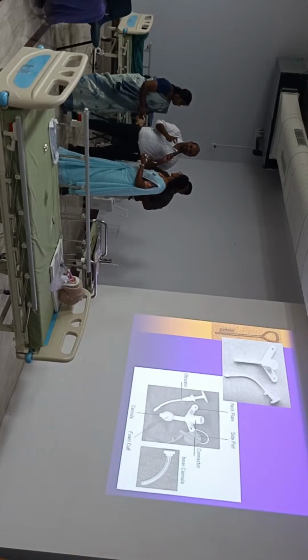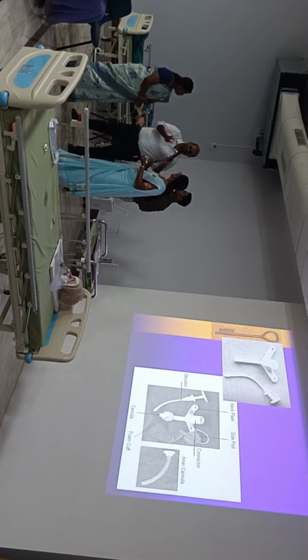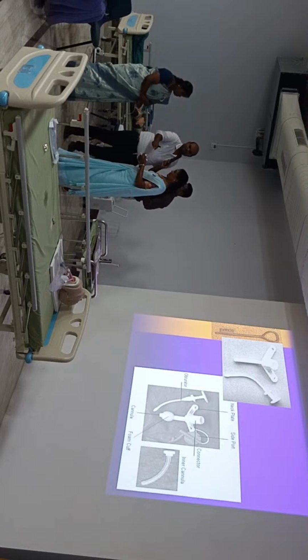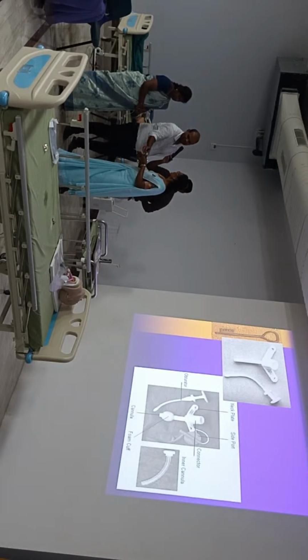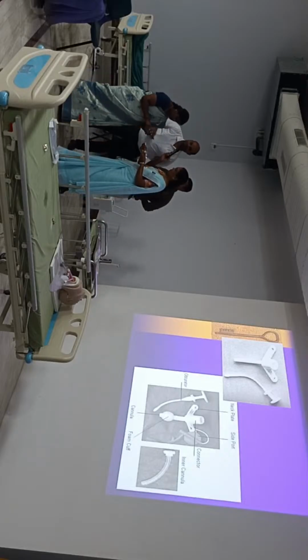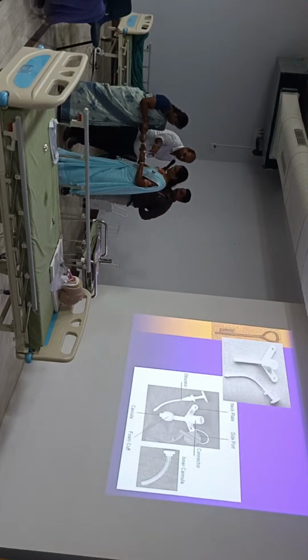Unless we are in a condition where there is a very small size tube, a very sick patient, or there is excessive bleeding, or we are anticipating long-term aspiration. If we are choosing the correct size of tracheostomy tube, then this size is more than sufficient to achieve a good seal for ventilation. This will also prevent aspiration. This is more than sufficient. Just insert 10 more. You hold, man. You feel the pressure.